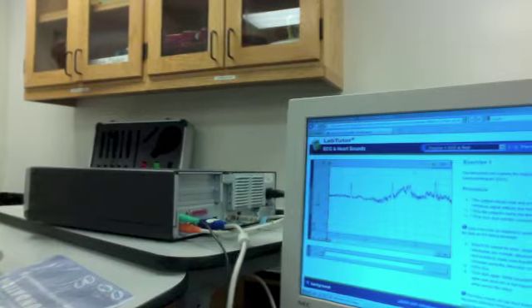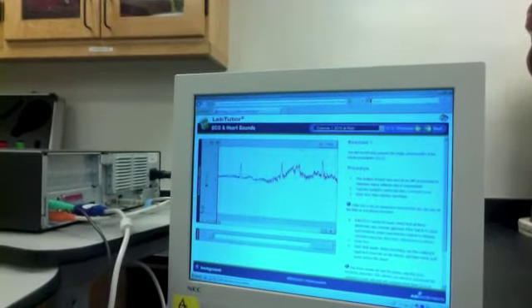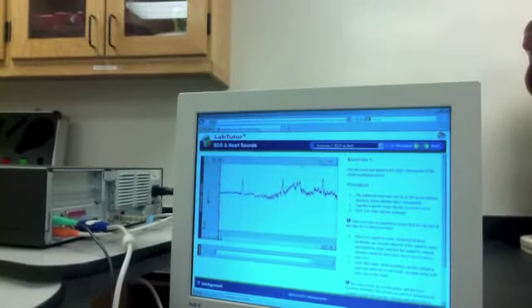You basically follow the screen. We'll be around to help you, and then we're going to come into the next section where we're going to record some data. Okay, so here we are on to step 2. This is going to be a little tricky because it's really hard to run this and record from yourself. As the instructions explain, you want to really make sure that the person who's getting recorded from is being still.